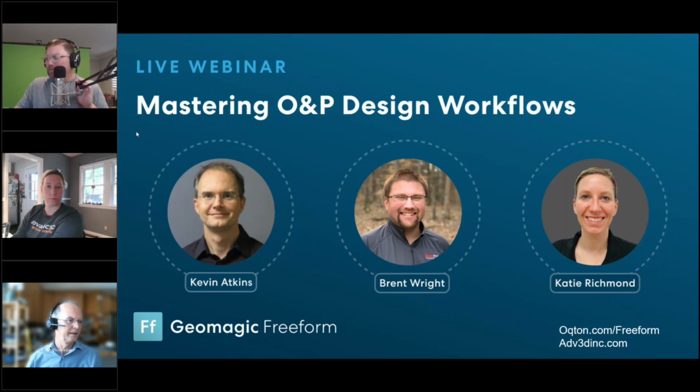Yep, definitely. And we do have a lot of customers who export to things like ANSYS and everything like that. But that's not something we particularly get into. We just do the STL export, or we can auto surface and then take those surfaces out. But then the actual FEA side to it, we're really hands off.